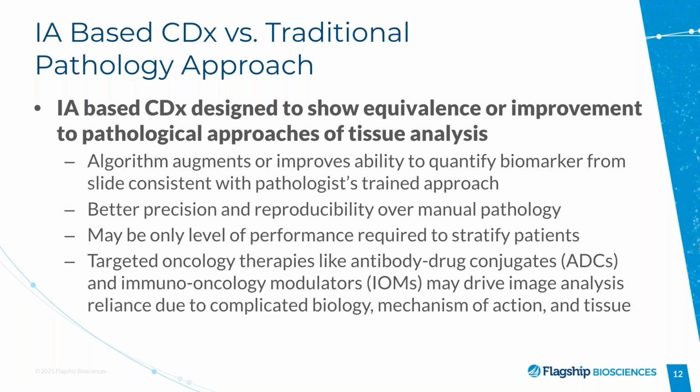But there are things that the computer can do better than pathologists, like being consistent, so increasing the precision of the outcome, and quite frankly, being more accurate when it comes to actually counting cells or dealing with a very large amount of data. So I think in the last analysis, the cooperation of the human, the pathologist, and the digital domain will yield the most appropriate way to negotiate all the information that is needed for these trials.